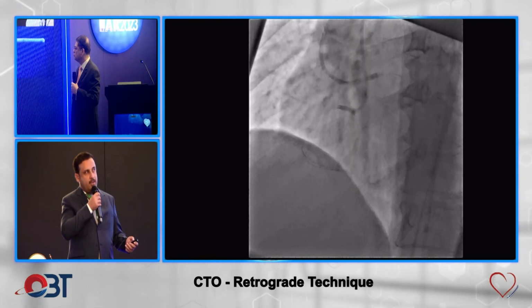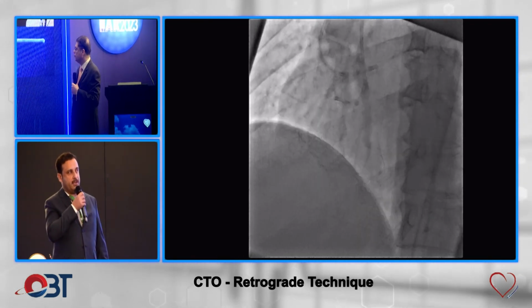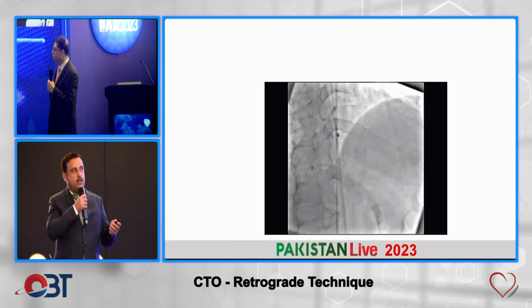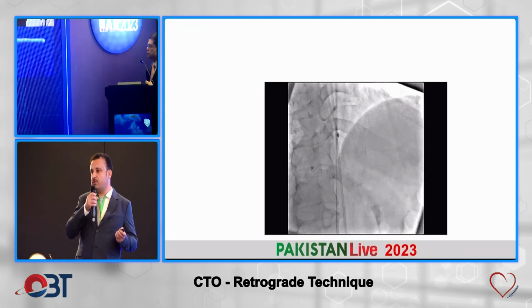Now we are removing the microcatheter through the balloon trapping technique. Can you please explain this technique? Yeah, so there are different ways to remove the microcatheter. One is the balloon trapping technique.